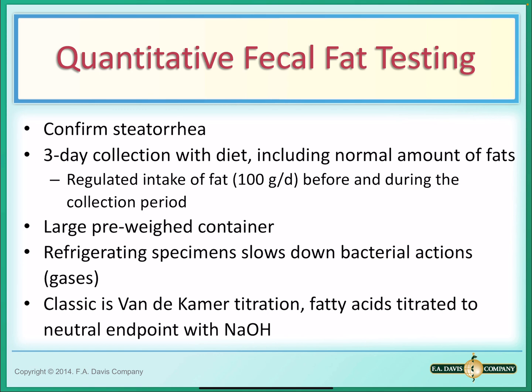The specimen has to be collected in a large pre-weighed container. Before the analysis, the specimen is weighed and homogenized. Refrigerating the specimen prevents any bacterial degradation.